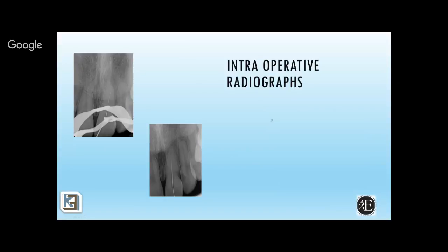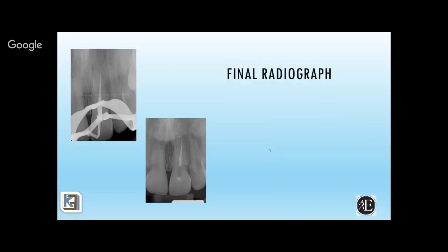This is, remember that patient we deviated from a little bit. So this is an intraoral radiograph as I initially popped into the canal using the drill, and I found it. That was my first file in, and then I was able to negotiate it and get to length. And this is my master cone and the final treatment outcome on that tooth. Now, traditionally, our access would never be that small. It would be much larger than this, and we would sacrifice a lot of tooth structure, both coronally and cervically, until we get to hit that canal.